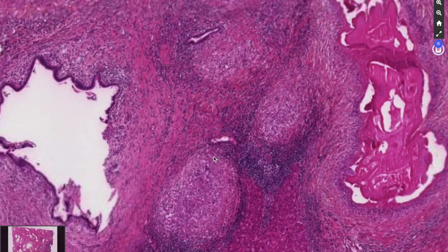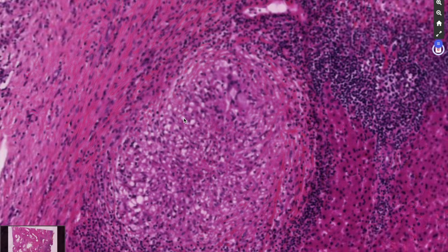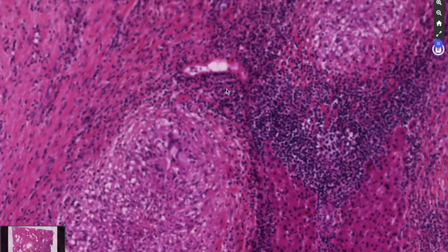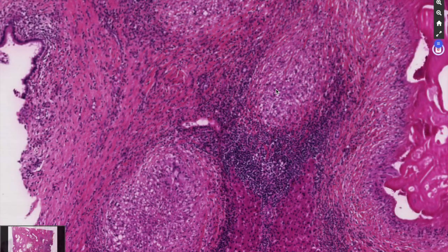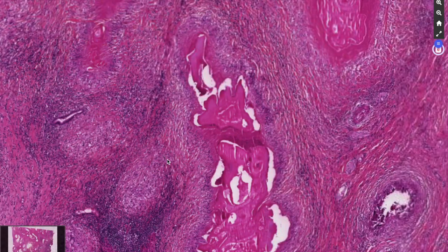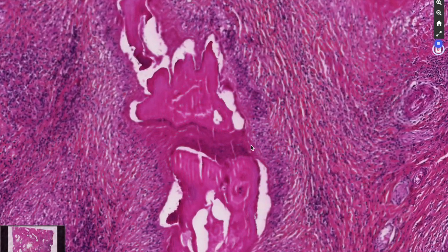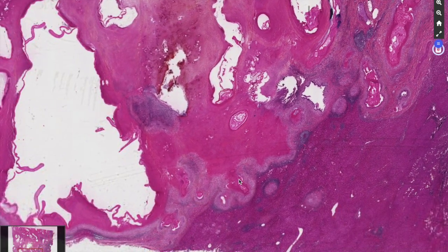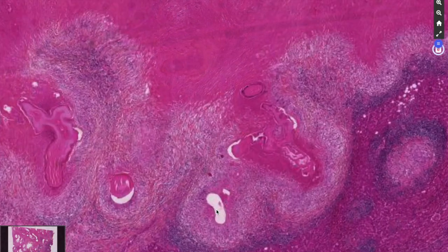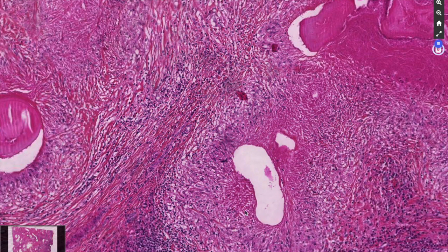Also here, some granulomas. Also here, sorry, it's kind of blurry. There must have been a problem with this part of the slide. You have a better aspect elsewhere. We go check another section of the slide. Hope it's better. Yes, here. Some granulomatous reaction, eosinophilic material.